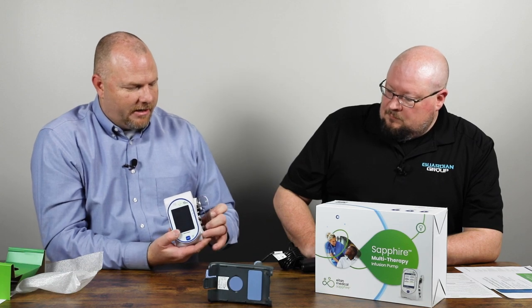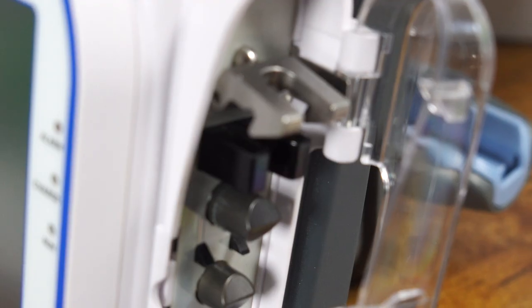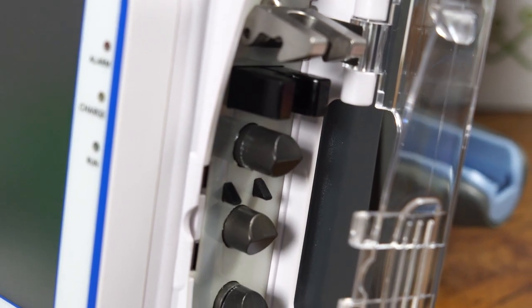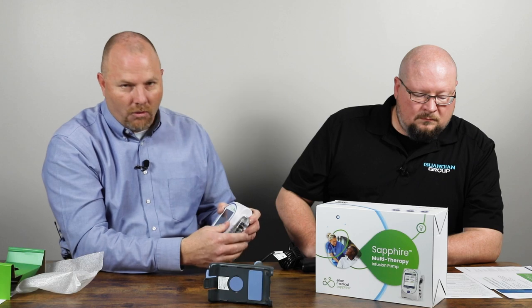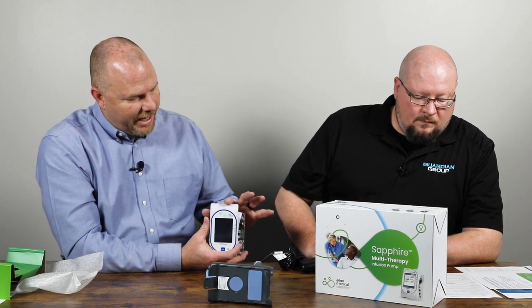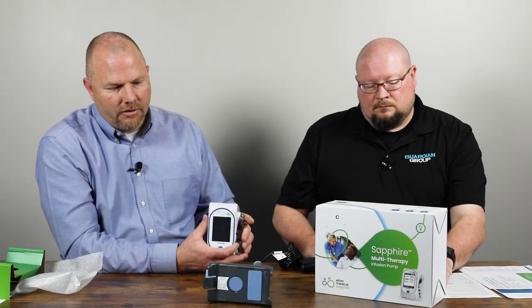They do have proprietary drip sets like most pumps — it's just a cartridge that snaps into the side here. A lot of folks ask: what if that door gets knocked off during an infusion? Is the medication going to stop? Whatever infusion is running will not stop. However, you do have to have the door in place to start a new infusion. So if for some reason this door gets sheared off mid-infusion, you don't have to worry about patient care at that time, but you will need it repaired or replaced prior to starting a new infusion.